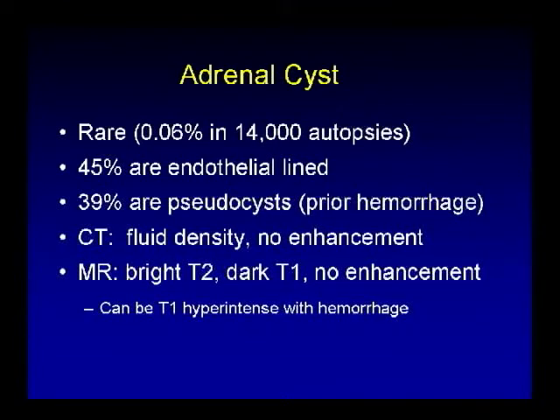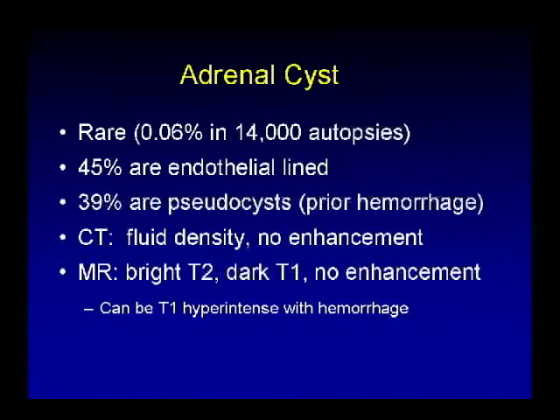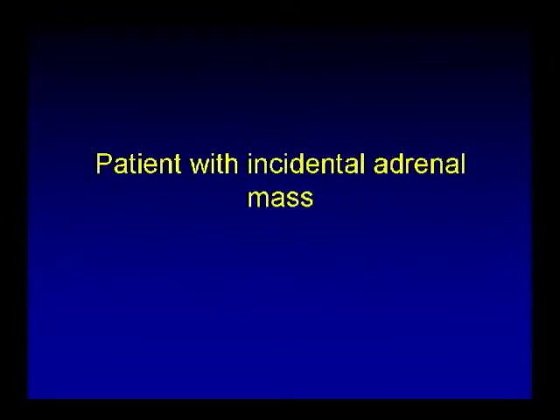MR T1 and T2-weighted imaging demonstrate a right adrenal mass that is hypointense on T1 and on T2 follows CSF signal — another case of adrenal cyst on MR. On CT, they are fluid density without enhancement. On MR they follow CSF signal but could be T1 hyperintense if there is internal hemorrhage.